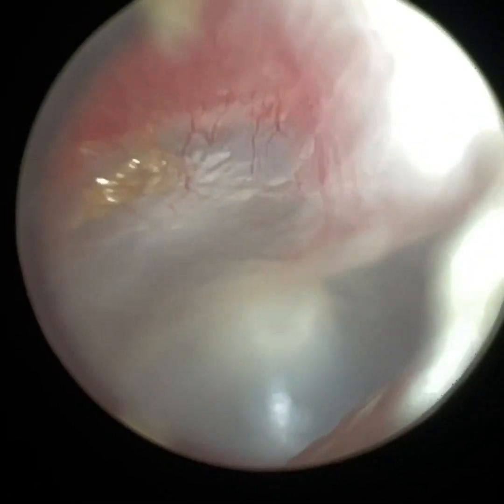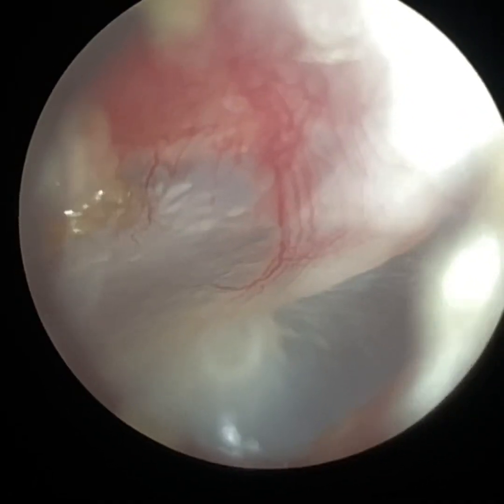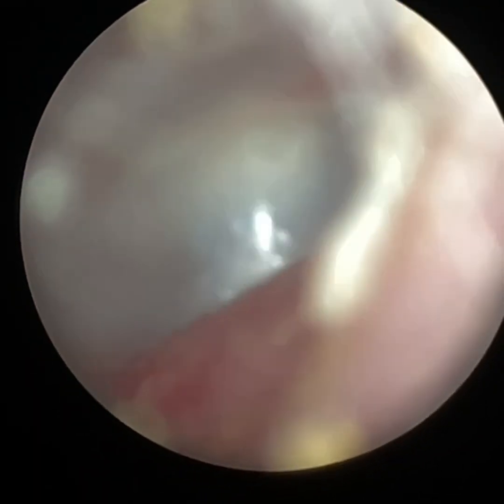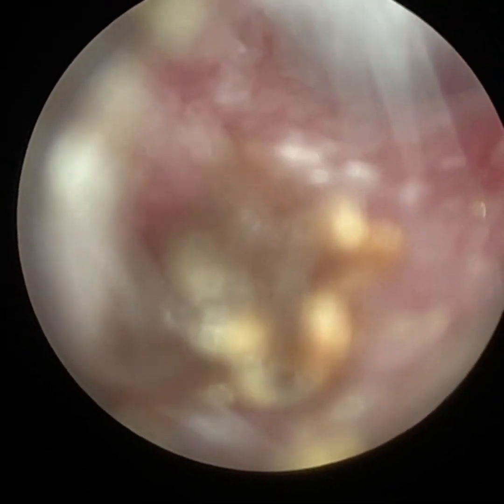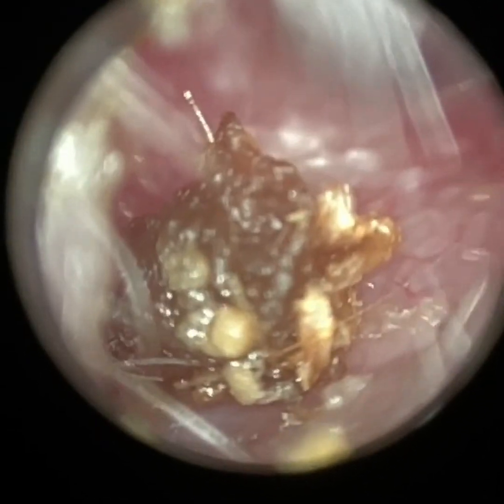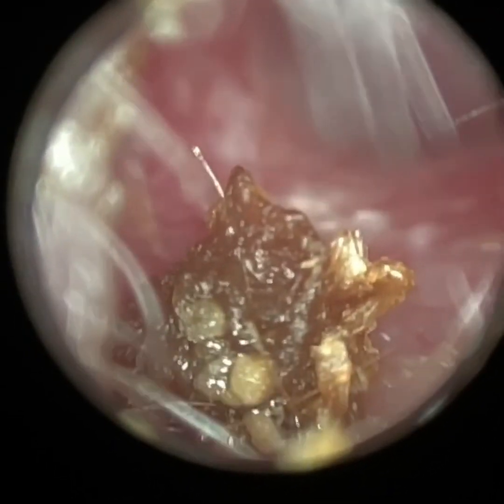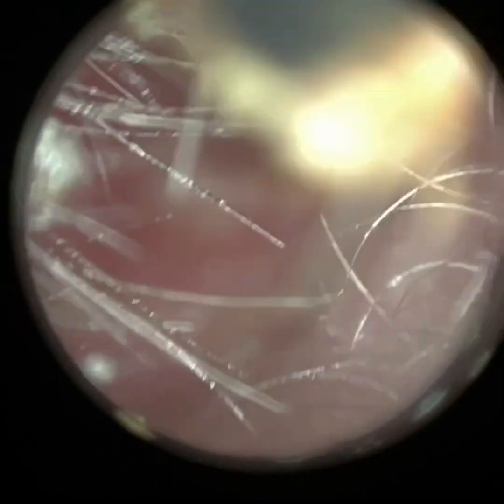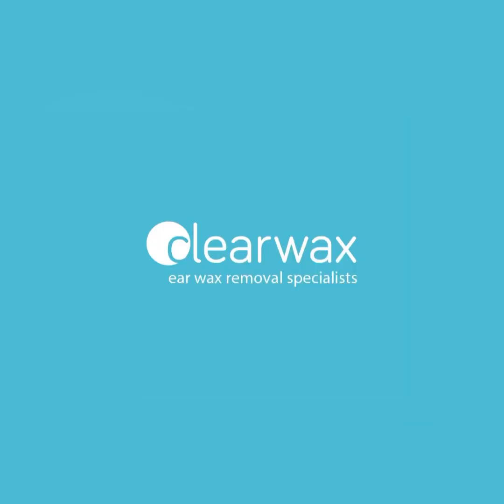I'm going to go back in in a minute. I'm just going to stretch the ear open because it's quite narrow on this side. I could have reverted to the smaller specular, but it's the end of the procedure. I'm able to widen the ear canal to visualize the whole eardrum. There's just a bit of skin on the floor, the base of the ear canal, so I'm going to use the suction probe just to remove that. And there we have it. I hope you enjoyed that video. Do take care, keep well, and speak soon.